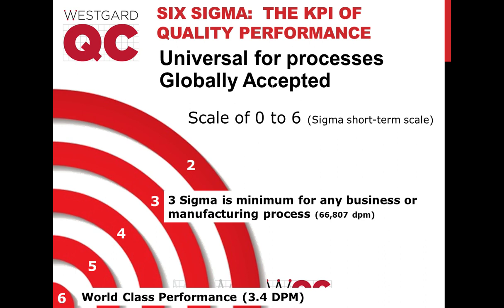So this is new, and I suppose it's an opportunity for labs to really apply and publish their results, because the science is only about 3 years old, and we're still trying to find laboratories to implement this and see what they find as the most useful, the most practical, the most effective way to implement these QC frequency policies. So it's one area where I agree that there's a challenge, and I think the math provides us with one answer, but the more interesting answer is going to come in the field from laboratories like yourself, to see what ends up being the best combination or the best consensus of the different capabilities of the assay.